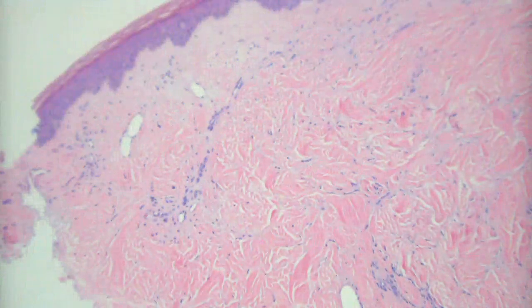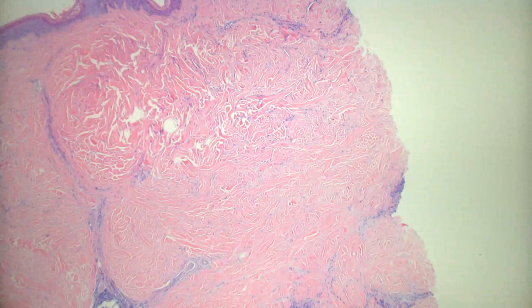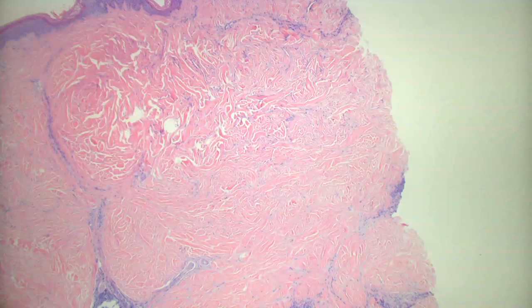So this is morphea. It's got maybe a tiny bit of lichen sclerosus up here, but the vast majority of this is a classic, beautiful example of morphea. And of course, here are some of the clinical photos. What's the clinical differential of this? You're looking at a picture, especially the back lesion. What else can do this clinically?